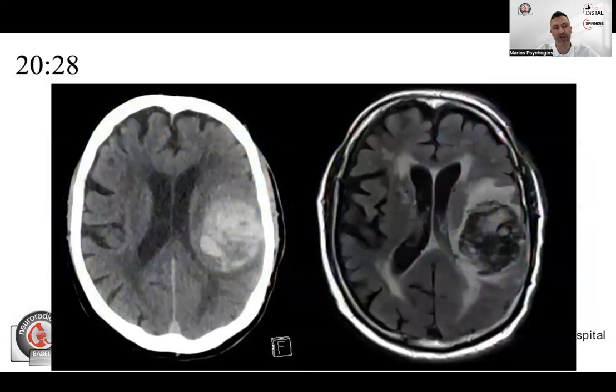And this is what happens after a couple of hours. So why I'm showing this is to just show you that this can be the natural course of a distal occlusion also, right? I know a lot of people think that when you use a catheter, you're going to produce bigger bleedings, and this is dangerous. But what I've seen in my experience is that something like this can also be the natural course of a stroke.